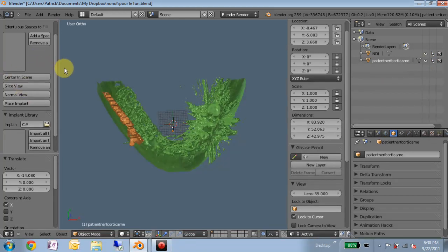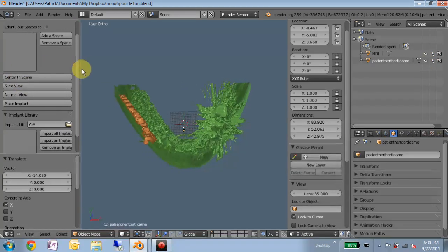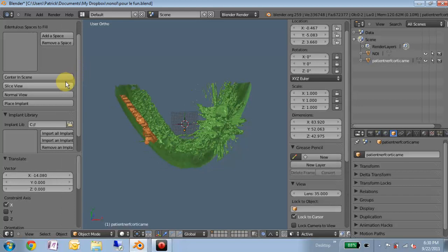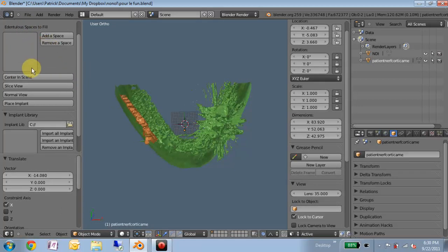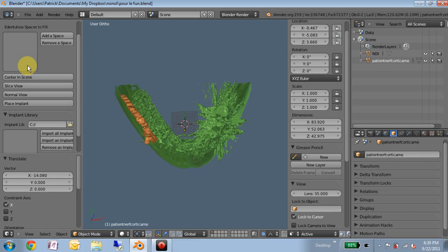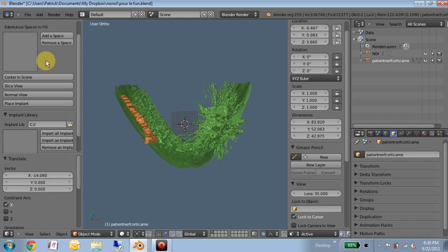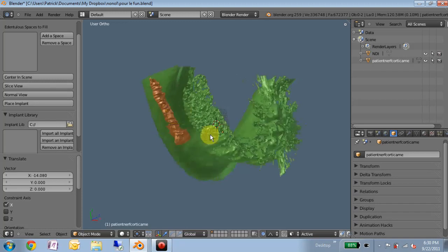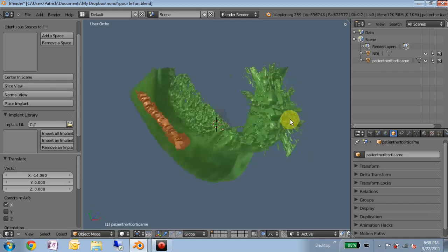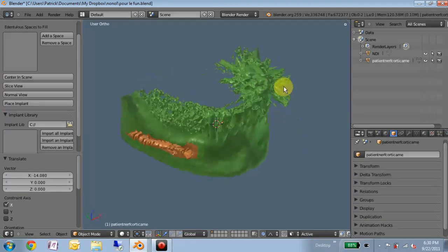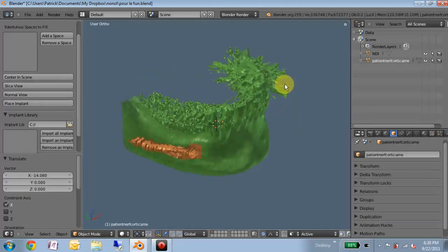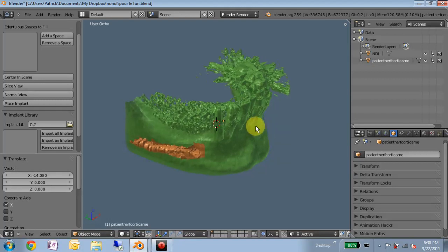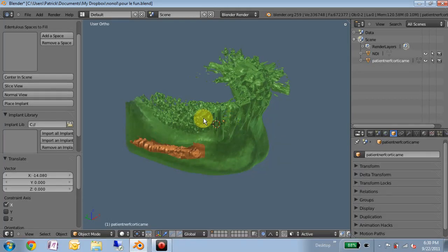So my add-on is organized by the edentulous spaces that you want to fill. These are just the ones that you're going to place an implant in. I know that an implant doesn't always correspond with a specific edentulous space, but a good way to keep track of what implant you're placing would be to assign each one a particular space.